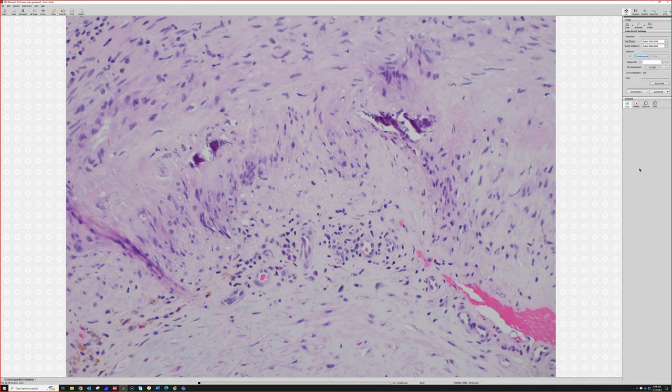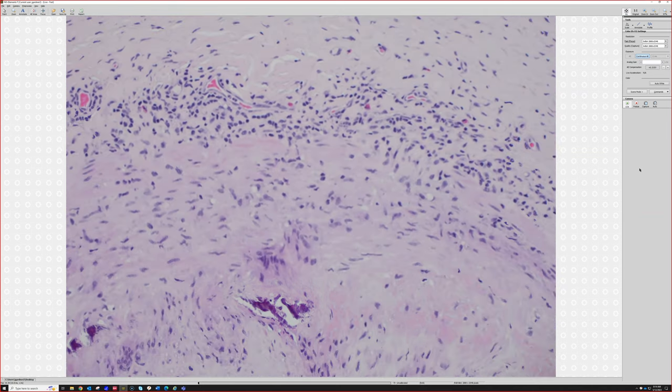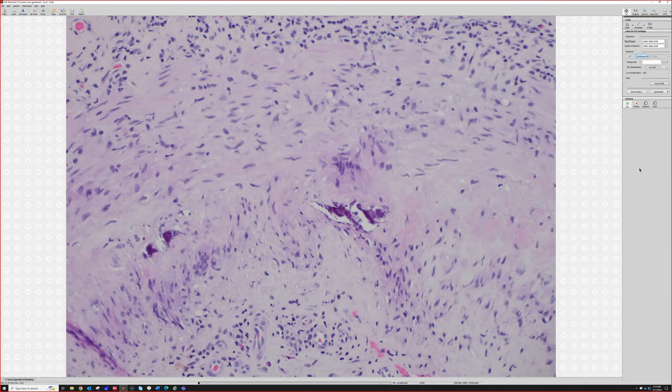That's giant cell arteritis. But even if I only see a little inflammation, a few histiocytes, any kind of inflammation or histiocytes in the wall of the vessel in that area, I'm going to be right away suspicious, and I'm going to look carefully around that area, cut some deeper sections on that area to look, because sometimes you can have foci of giant cell arteritis that skip, and we'll have an area, and then normal vessel, then another area. So that's why we cut the deeper sections to find it, okay? So a lot of times these patients have been treated before we get the biopsy, which is the right approach: if there's any suspicion, clinically they give them steroids and then send them for temporal artery biopsy.